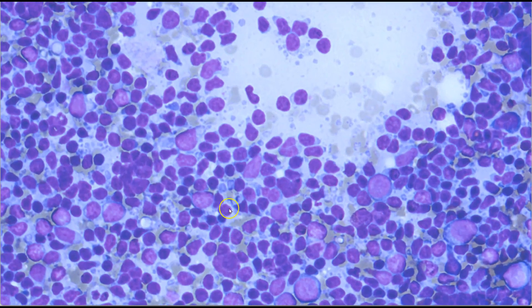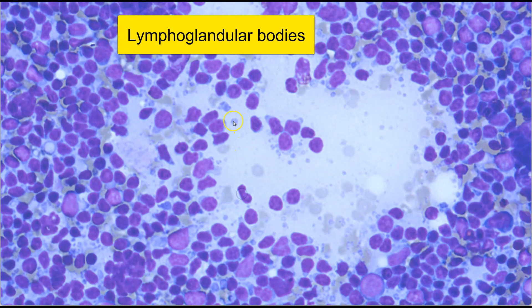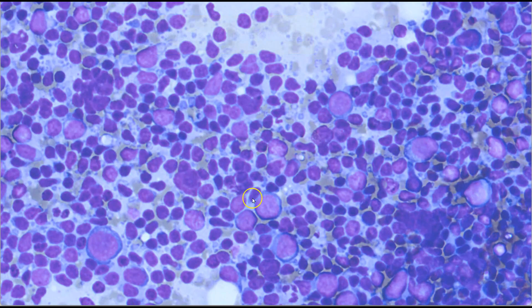I also want to highlight the presence of lymphoglandular bodies, as you can see here and here, as well as a few smaller ones here surrounding the lymphoid cells. These are a very useful indicator that we are dealing with a lymphoid lesion. They do not differentiate between reactive or benign lymphoid cells versus malignant lymphoid cells, but they are a good indicator that we are likely dealing with a lymphoid lesion.